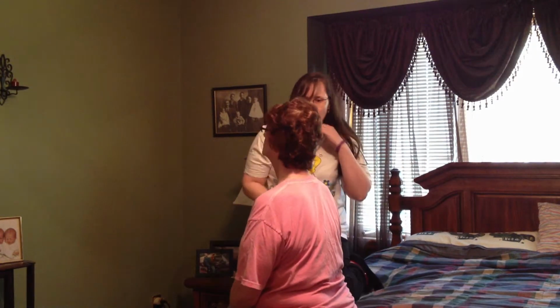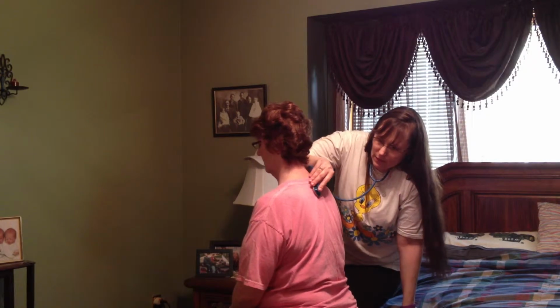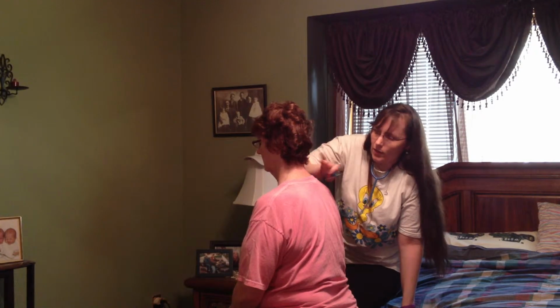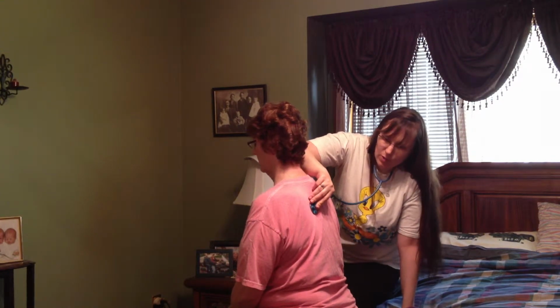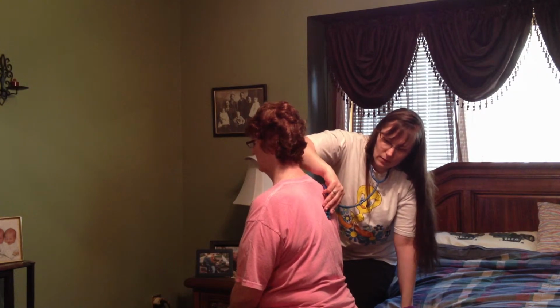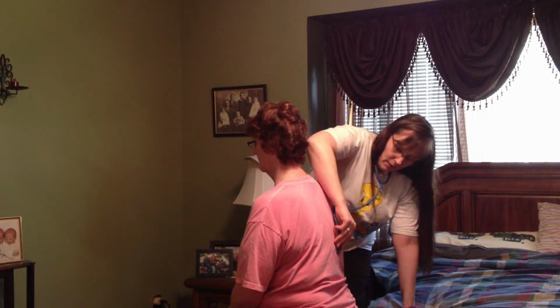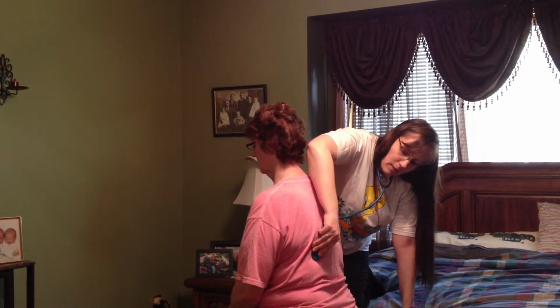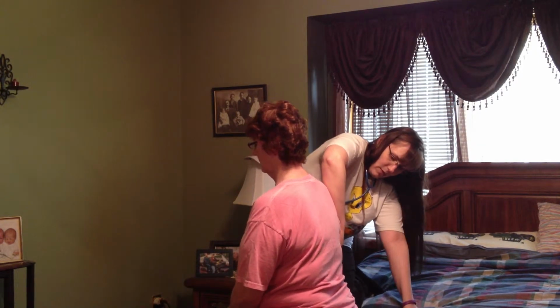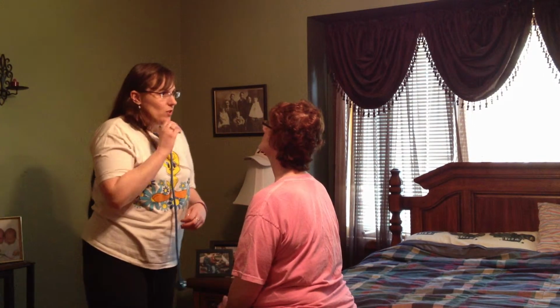And then I would auscultate, and I'll have you take a deep breath and exhale, and take a deep breath and exhale. And I'm comparing side to side. You don't have to take a deep breath anymore. I'm just going to pretend that each cycle I'm replacing the stethoscope. Listening for any crackles, any rales, any wheezing. Lower left, lower middle.